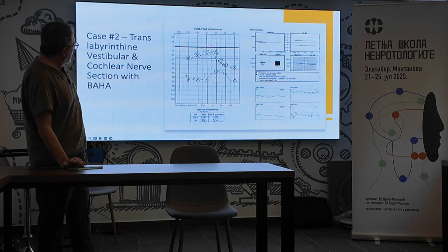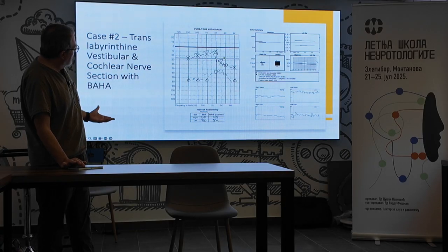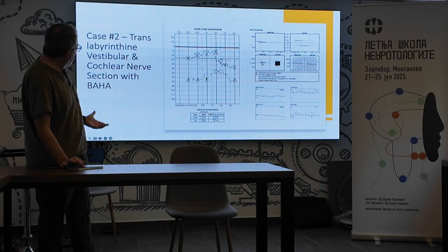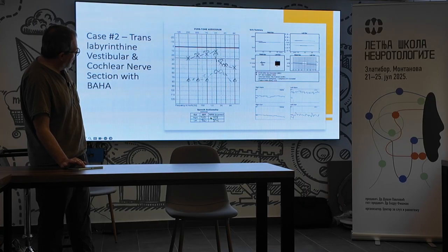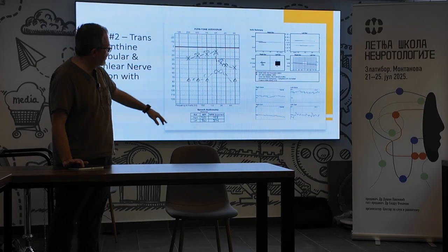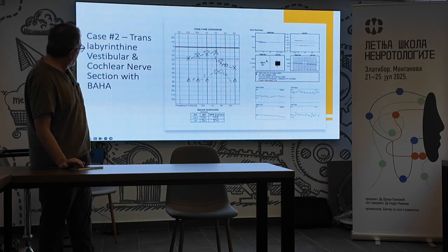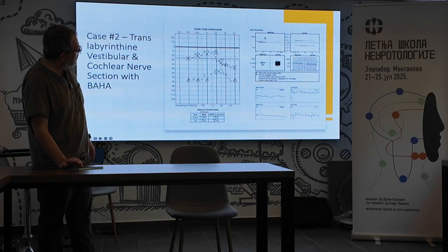Here is another patient. So let's look at this patient. You see, not so different audiogram pattern, but worse word recognition score. Now, this 48% in this right ear is in a category, and this was a more consistent low functioning ear. And look at the testing, very poor performance in the right ear in caloric testing.